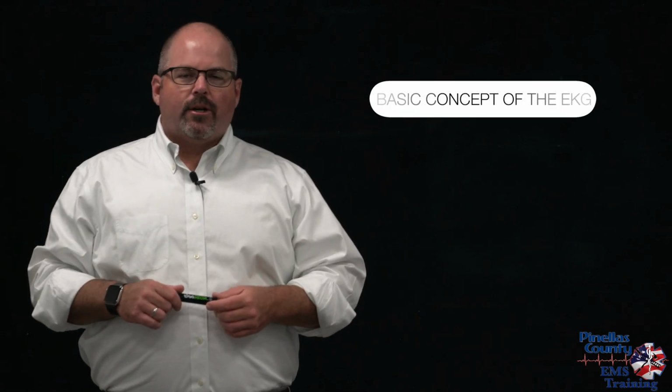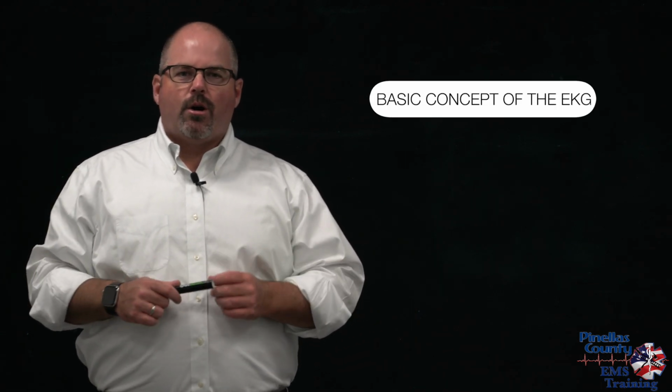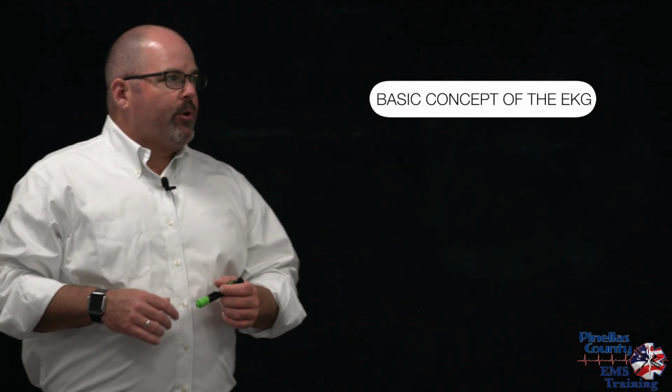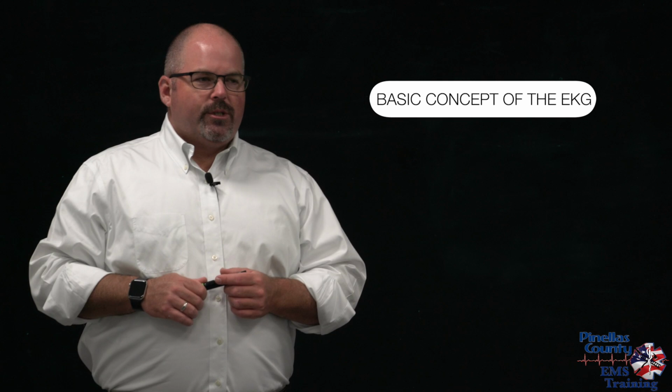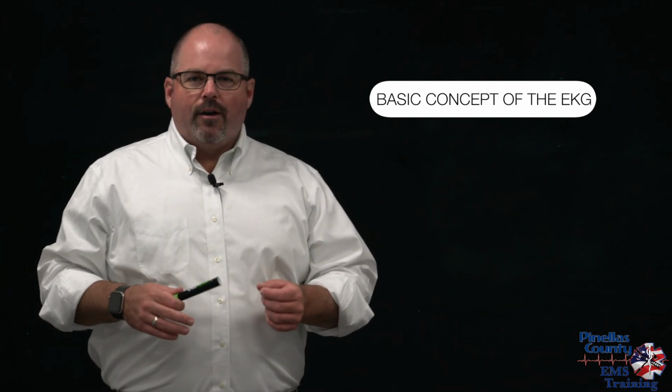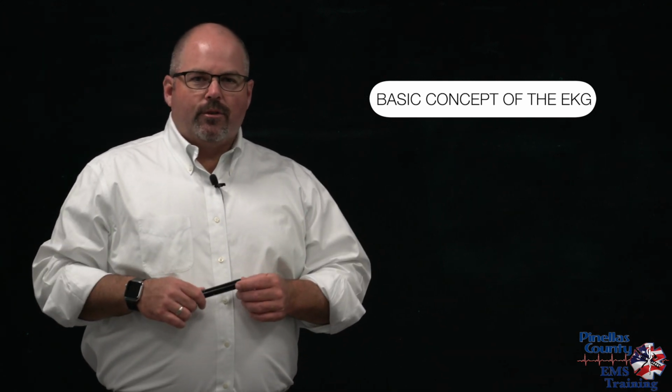The next thing I want to talk to you about is the basic concept of what an electrocardiograph or an electrocardiogram is. And I want you to remember that just like a lot of the things we look at on our monitors, this is actually a graphical representation of data. So we have a plethysmograph, or plethysmography, for pulse ox. We have capnography or capnograph for CO2, but we also have an electrocardiograph.